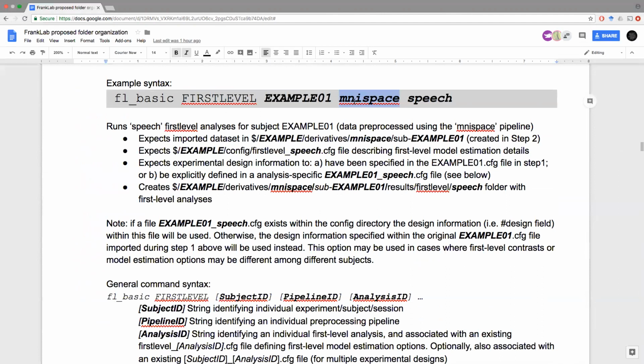So, for example, when you run first level analysis on the surface, everything is pretty much the same. When you run second level analysis on the surface, it will give you only the ability to do non-parametric analysis, because the parametric version of this analysis of cluster level statistics is not available for surface level data. But it will basically all happen behind the curtain for you automatically.